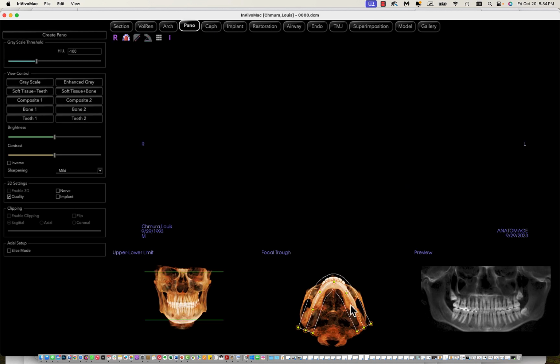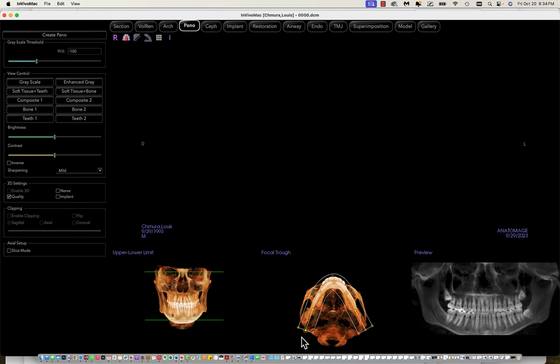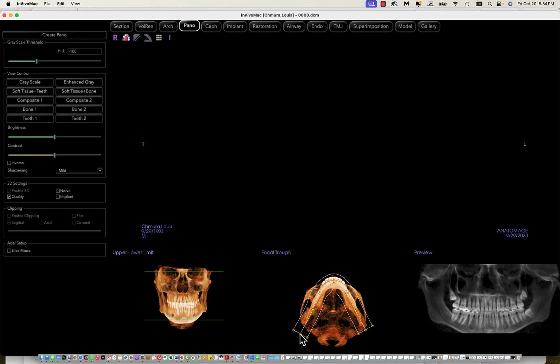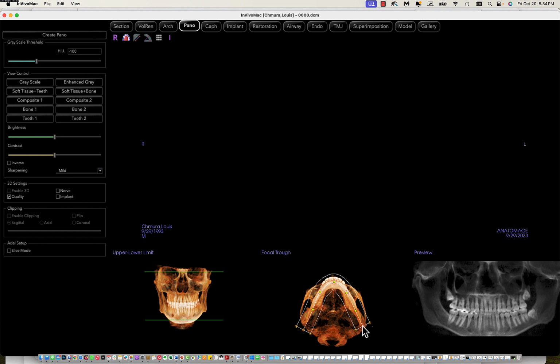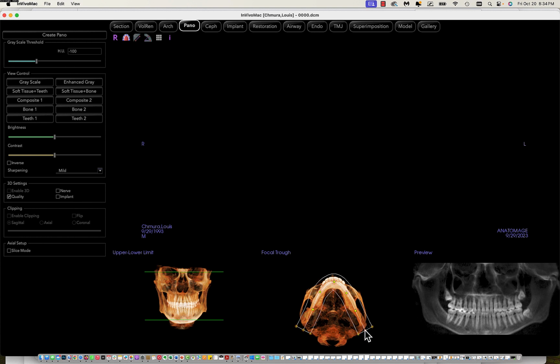Then on your panel, you will get what you want. And if you want to see a little bit more behind the condyle, you just move these back a little bit. And you can watch what happens here. Obviously, there's not anatomy there, okay? So if I do the opposite on the other side, see how you lose it? Take it back to the end of the anatomy, then you can see the condyles.